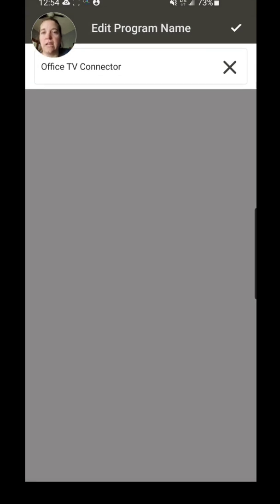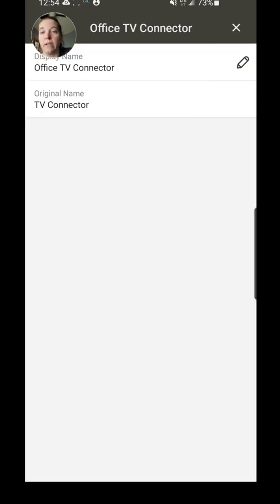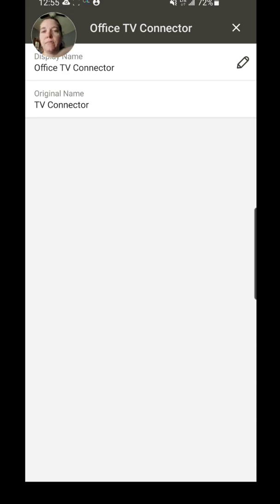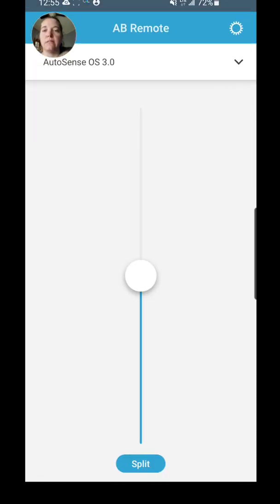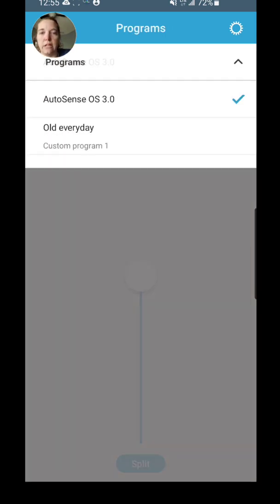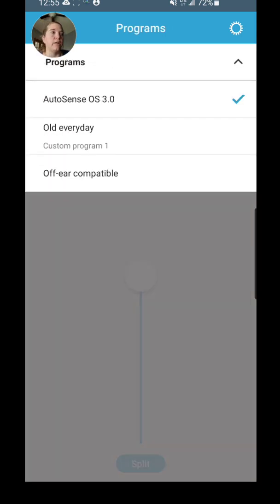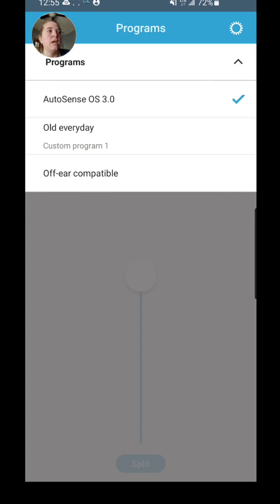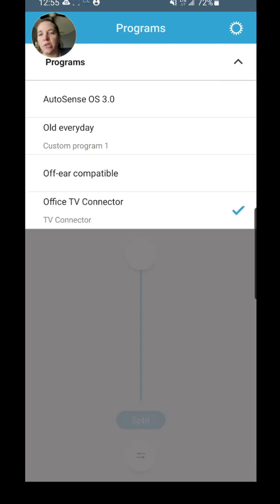You can change the name, and then once you've named it whatever you want it to be, then you'll be able to choose which option you want to be focused on or which program you want to be connected to. So I'll give you a little example here. I'm going to fire up my TV Connector because I have it here, and you'll see as soon as my TV Connector starts streaming, the option for that program pops up.